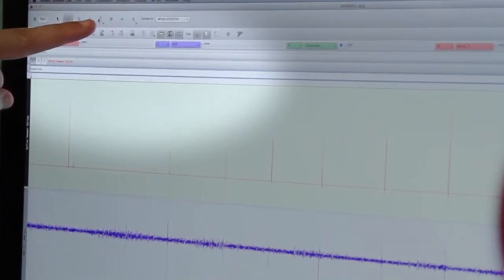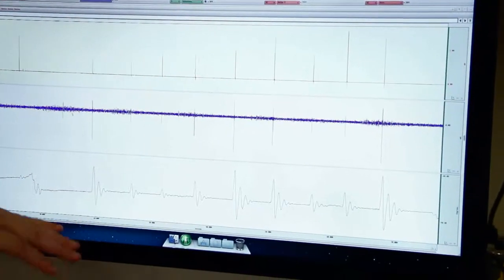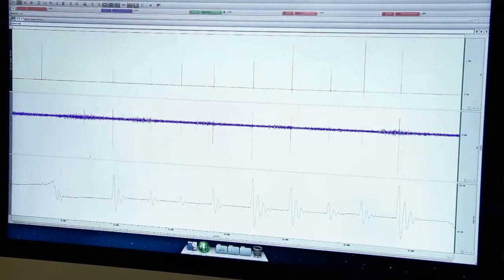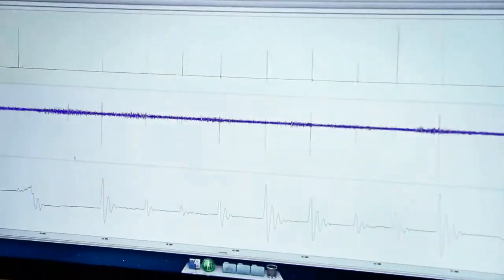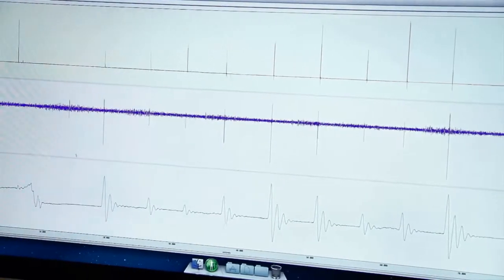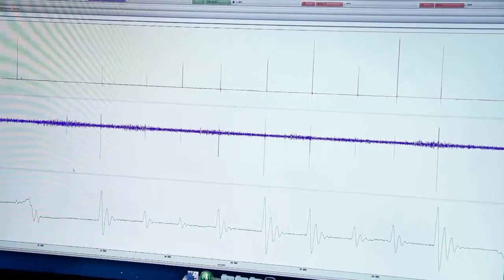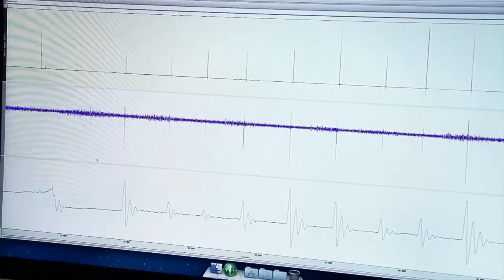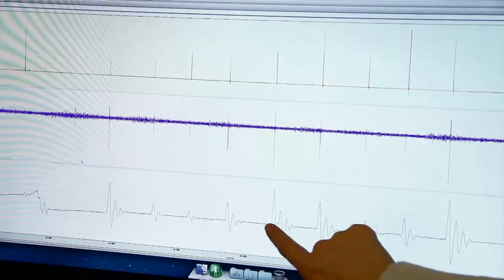Looking at these, we have several that are similar. I would say these 4 are probably the best. Danielle, which 3 do you think are the best responses? And you should look at the EMG too and look for noise. So we want consistent hammer strikes, not a lot of noise on the EMG, and consistent goniometer tracing. I'd say these 3 are the closest.